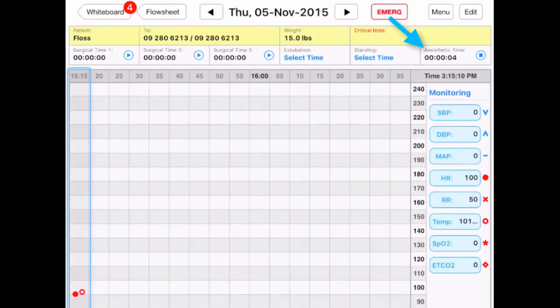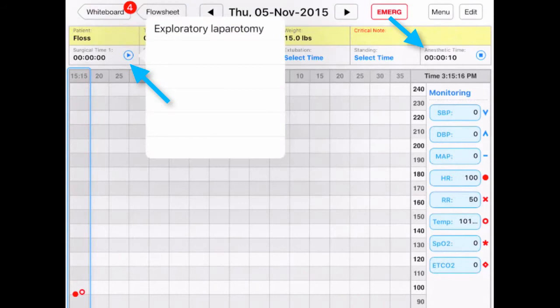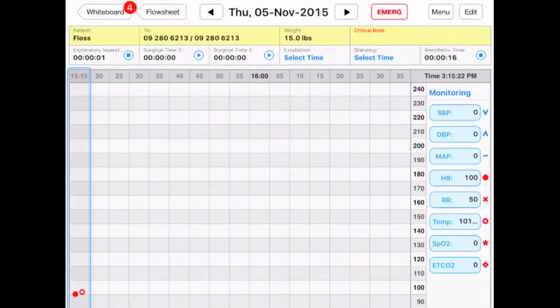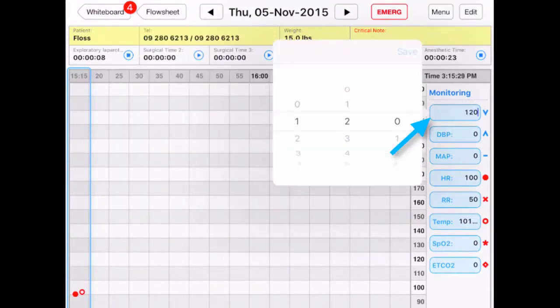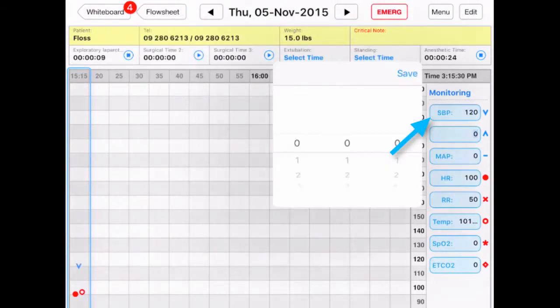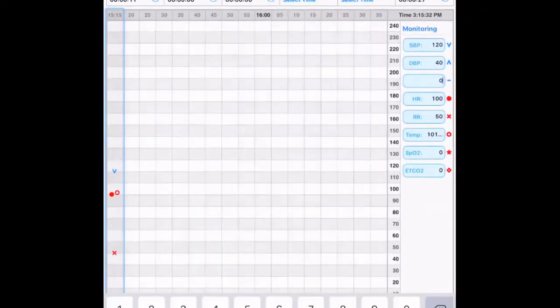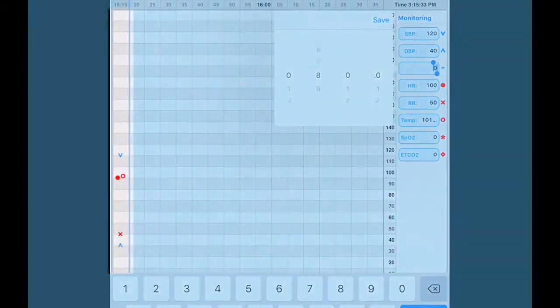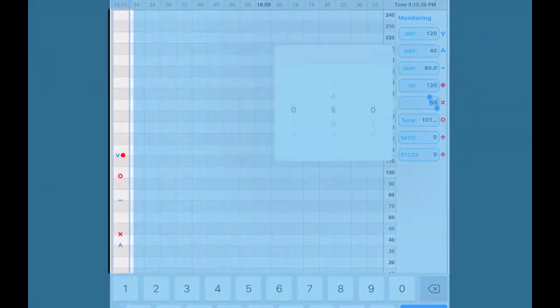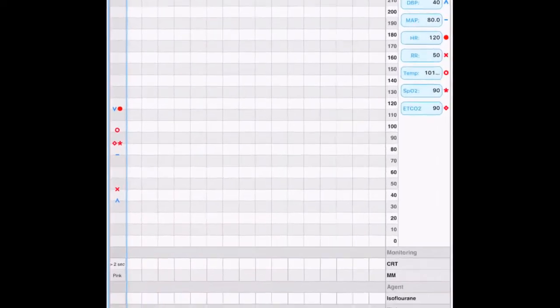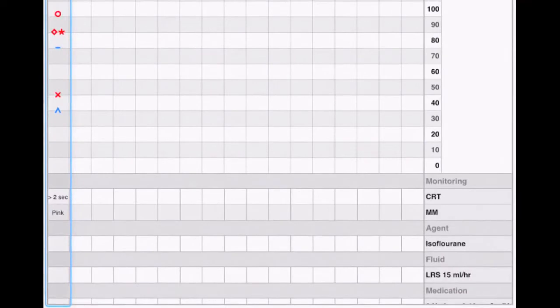Here we can record the anesthetic time and the surgical time. To record vitals, press and hold here. As you record the vitals, they will be graphed automatically for you. Other information can be charted at the bottom of the page.